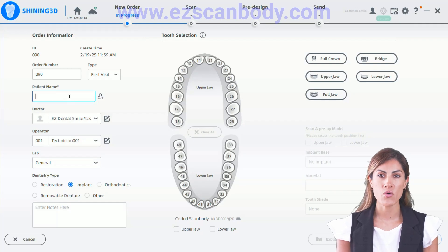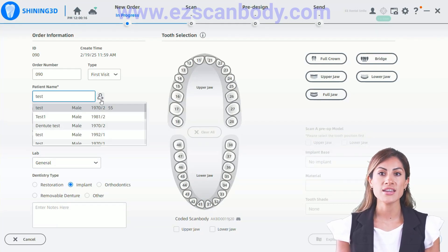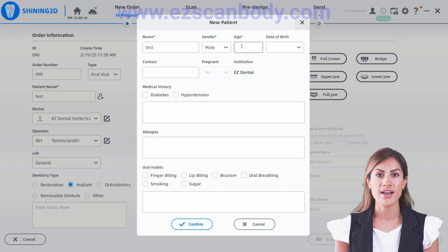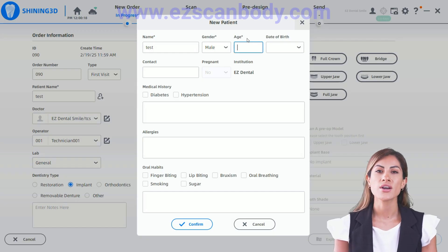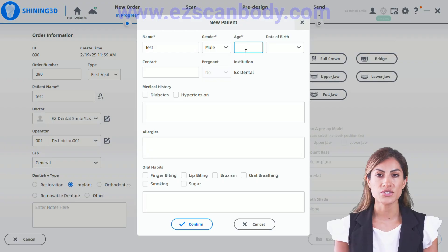To scan an OR1X implant case with a Shining 3D Elite Intraoral Scanner, first enter the patient's name and make sure to include their age, as the software will not proceed without this information.